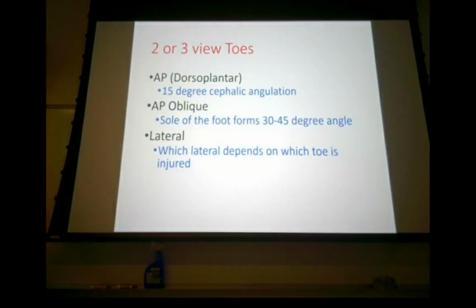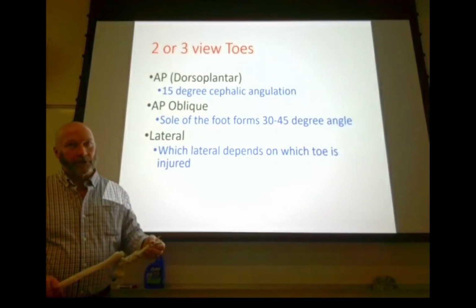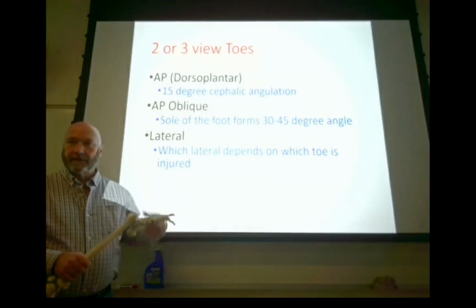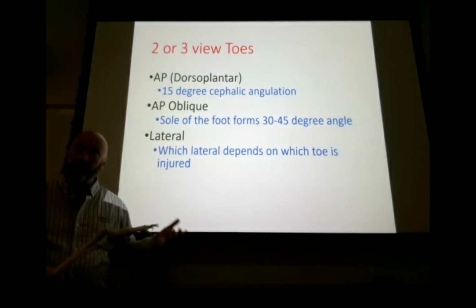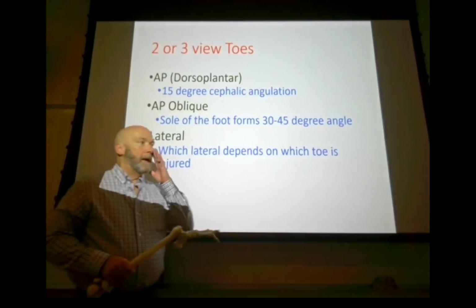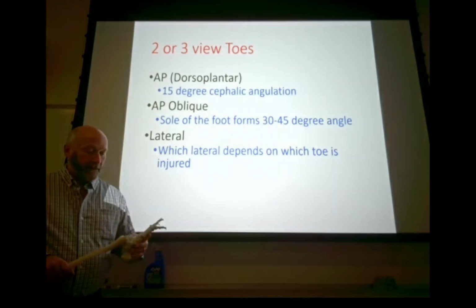For toes, it's a little bit different. With toes, whichever toe the patient's hurting, or whichever toe hurts on the patient, that's what side we're going to put down. Right, so if their trauma was on the medial side, you put the medial side down. If trauma's on the lateral side, which most of the time in my experience is where the damage is, somebody gets up and they kick something real hard in the middle of the night and they break a toe, then it'd be the lateral side down.